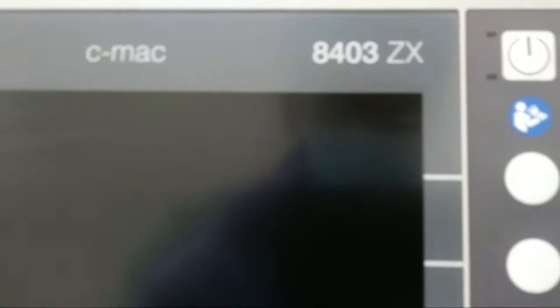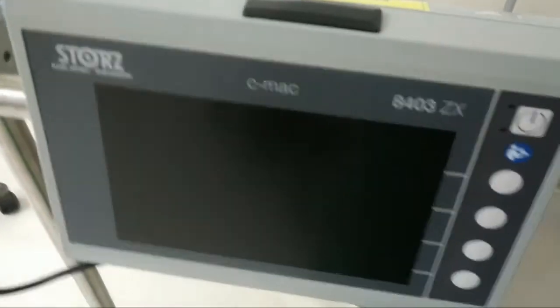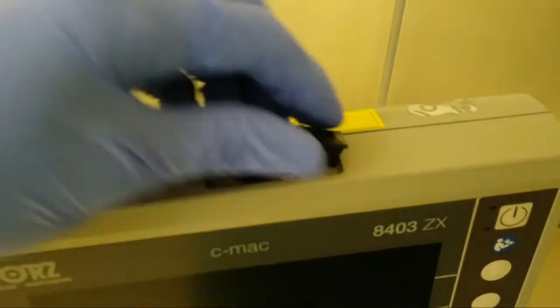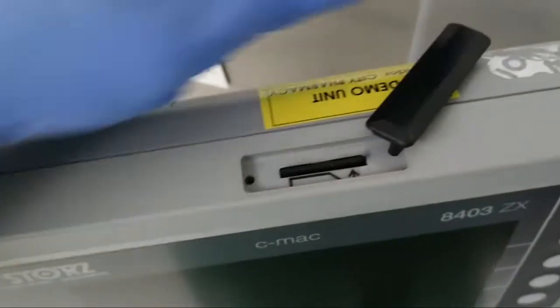Today we are familiarizing a new equipment, the C-MAC video laryngoscope by Karl Storz. It is a good equipment. Its advantage is that we can decrease the direct exposure at the time of endotracheal tube intubation. Nowadays its usage has increased because it encourages safe practice of endotracheal tube intubation. This is an SD card slot to store images and videos safely.